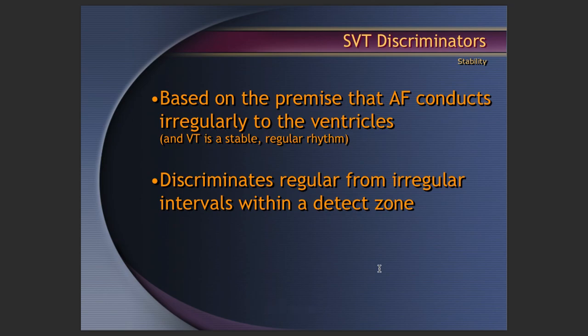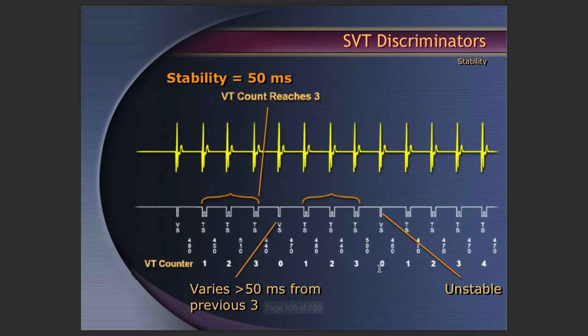This is actually an algorithm which is used in Medtronic devices. What it shows is that the SVT discriminator is not met, in fact. It is on the premise that AF conducts irregularly to the ventricle, and then you can discriminate the regular from the irregular intervals within a detect zone.